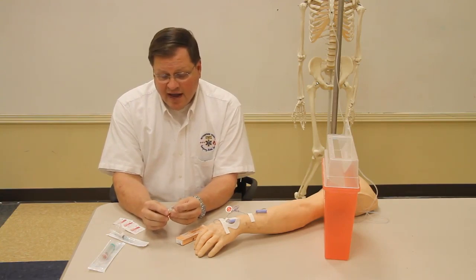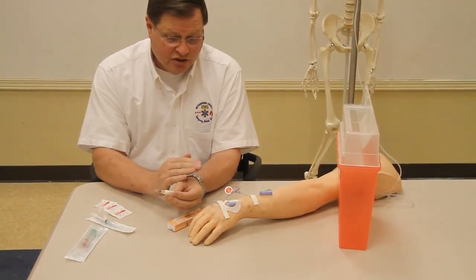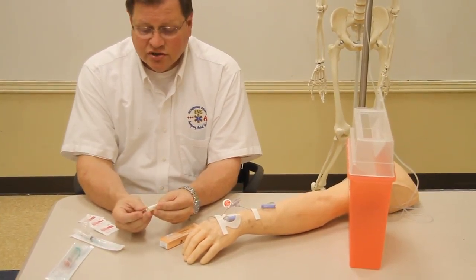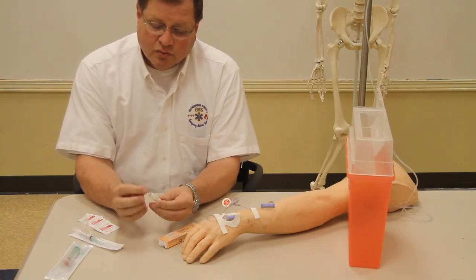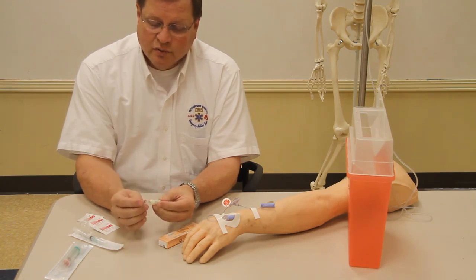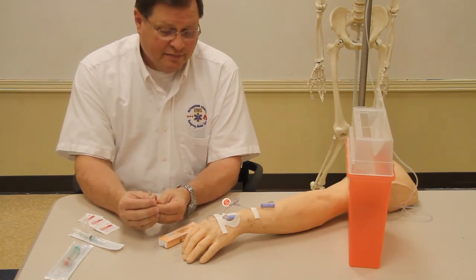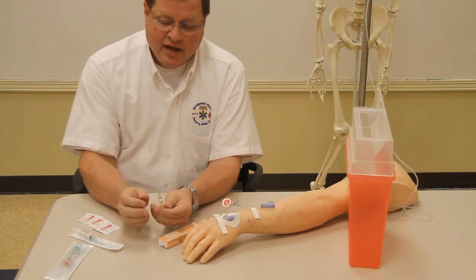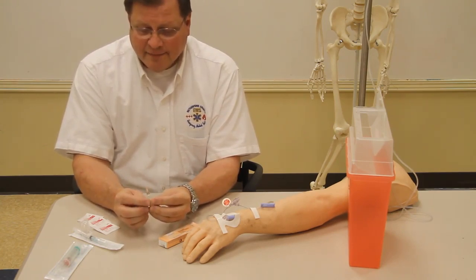The first thing we want to know about the ampule is that it is the right medication, it is the right patient that we're giving it to, it is the right concentration, and this particular concentration is 2 milliliters, and there is 1 milligram per milliliter. It is the right color. The color should be clear, and it is the right expiration date to make sure that we are within the expiration date. So after you've made sure that all of those things are complete, and making sure that the IV, our right route, is complete and patent, then you can open the vial and take the medication out.